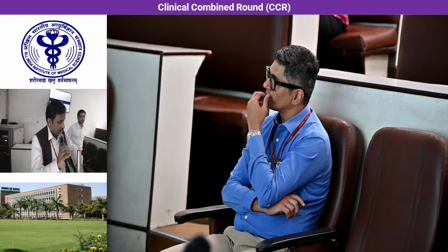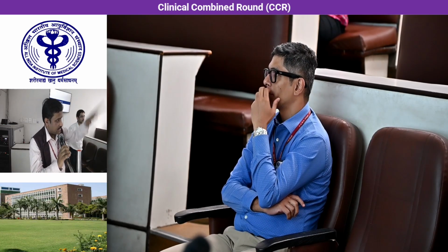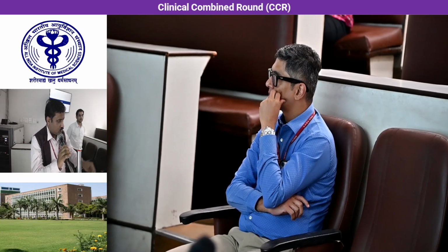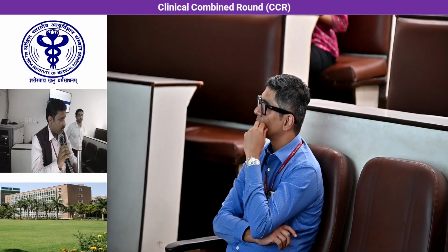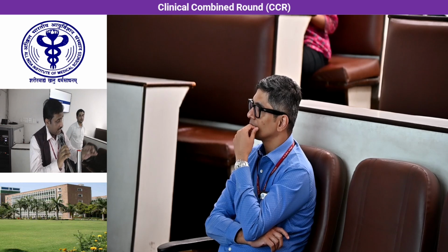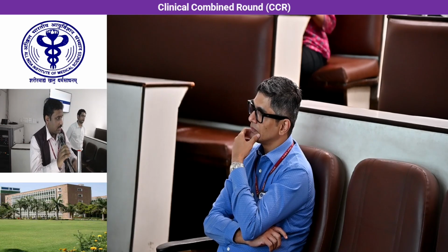The patient had a left-sided tumor with renal vein thrombus extending till the right atrium. The tumor was already in the right atrium. But when I did the nephrectomy, I put the clamp on the renal vein and detached the specimen. At that point in time, the complete thrombus, even though it was in the right atrium, all embolized into the pulmonary artery. The patient had sudden hypotension, and in fact, he had asystole for 1.5 minutes. I had to do cardiac massage there in the CTVS OT, but within 2 to 3 minutes, the CTVS team opened the chest and did a pulmonary embolectomy, and the patient has already gone home. Now he's okay. So this embolism can happen anytime during the course of the surgery. That's the reason it's very risky to deal with these patients.